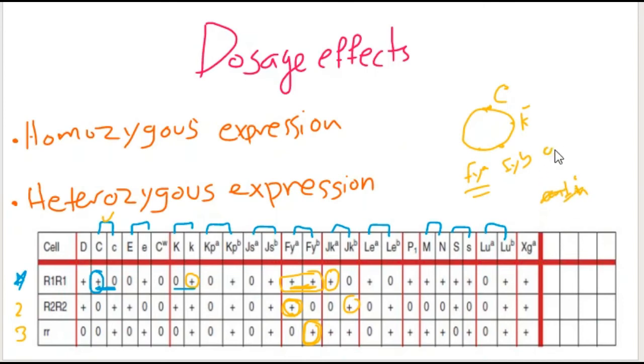Let's say the patient has anti-JKA. The patient may react with these cells and give a positive, for example 3, and here 0, and here maybe 0 again. Why is it 0 again here when the antigen is present? Because it's heterozygous expression, so the number of JKA antigens is quite low, and we may miss the reaction.